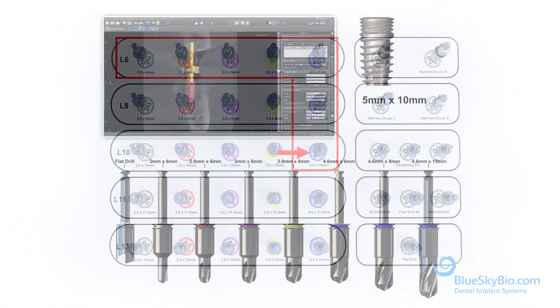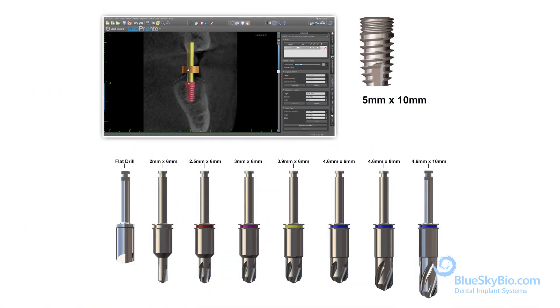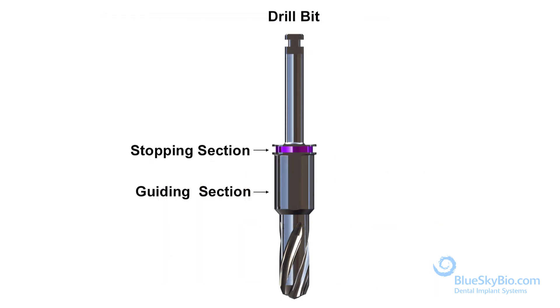When choosing the Biomax 5 mm x 10 mm implant, use these specific drills. The drill bit consists of two parts: the stopping section and the guiding section.